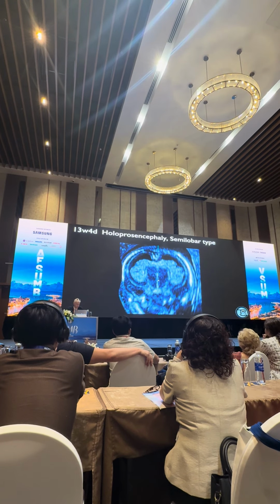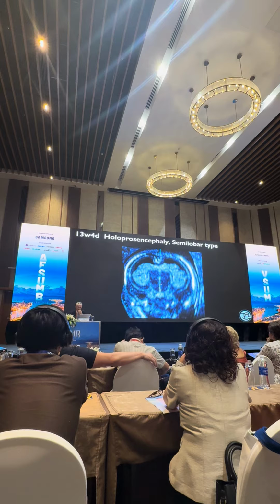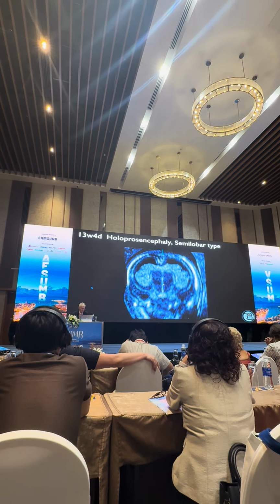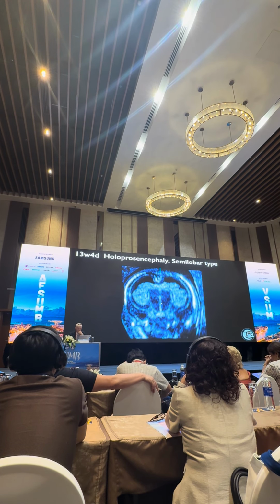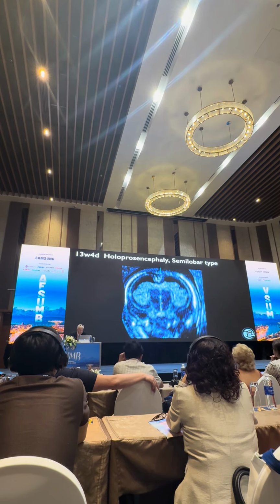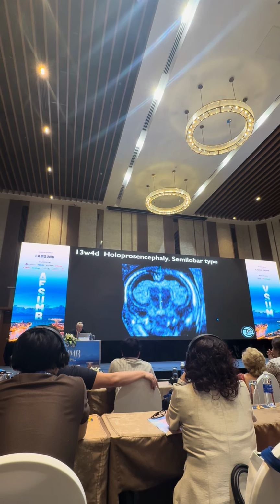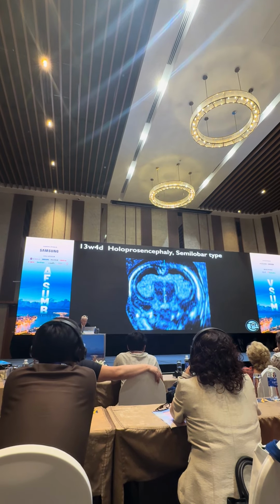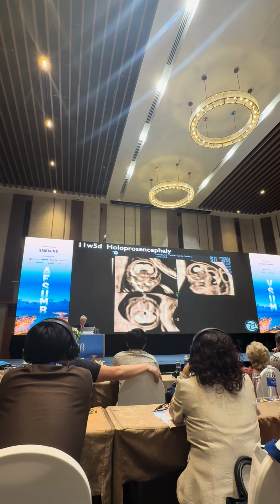trimester. Now, in the case of holoprosencephaly, for example, here this is 13 weeks of gestation. I already showed the 9 weeks holoprosencephaly, and the choroid plexus is only one. And here you can see this is a semilobar type of holoprosencephaly, and you can see the choroid plexus continuing from the left to the right ventricle, very obviously. And this is 11 weeks and 5 days.